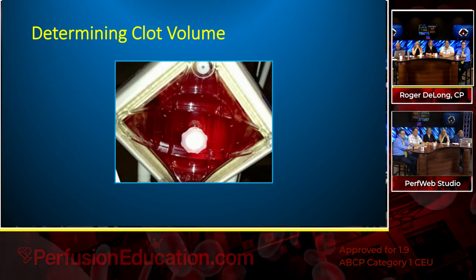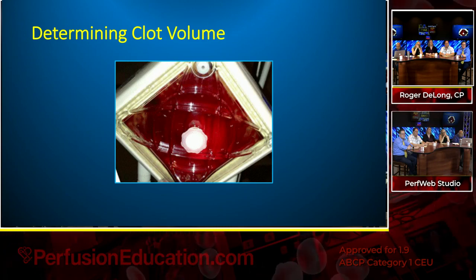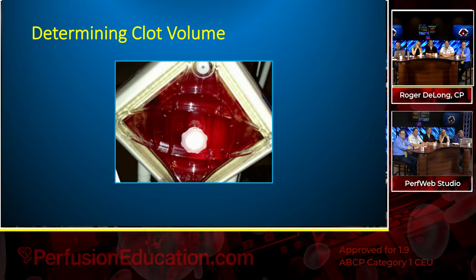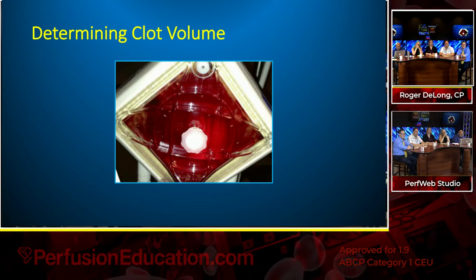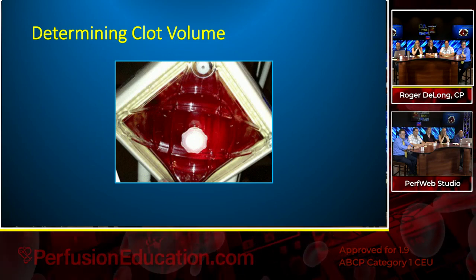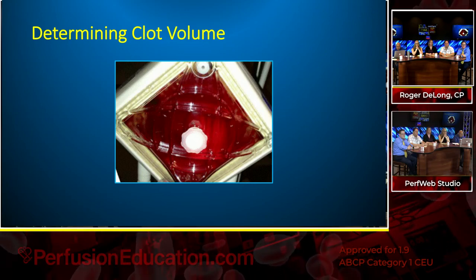All right, here's an oxygenator that was rinsed out, and it had a nice layer of soft clot. The oxygenators we'll be talking about, with some apologies to Maquet, generally they produce some pretty good equipment, but well over 95% of all the ECMO units are using the Quadrox, one of the models of Quadrox. So we'll be discussing this one primarily, but the problems I'm discussing also are pertinent with cylindrical oxygenators. But let's have fun with the Quadrox here.